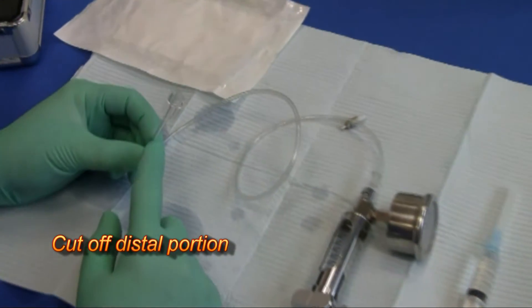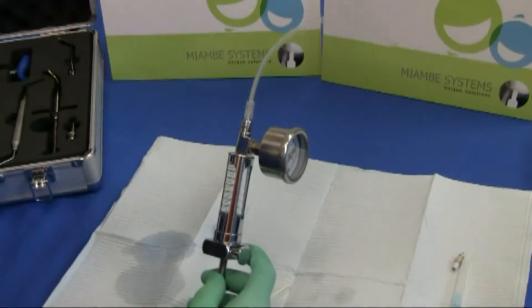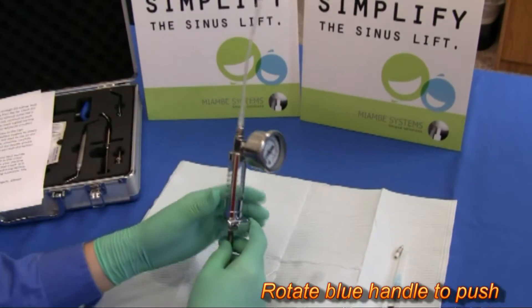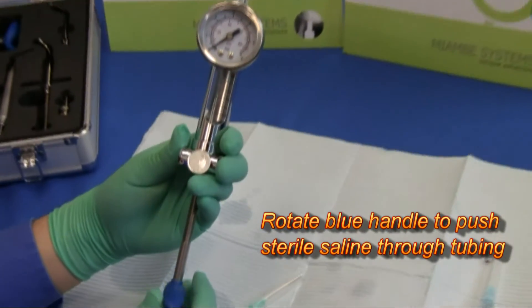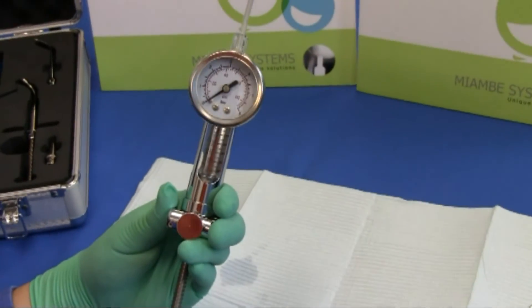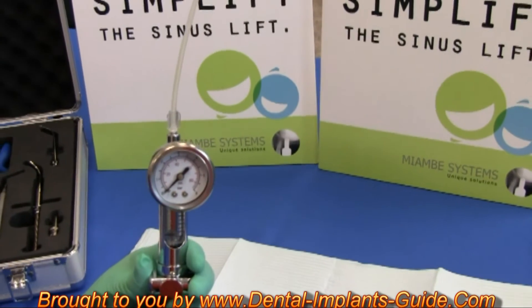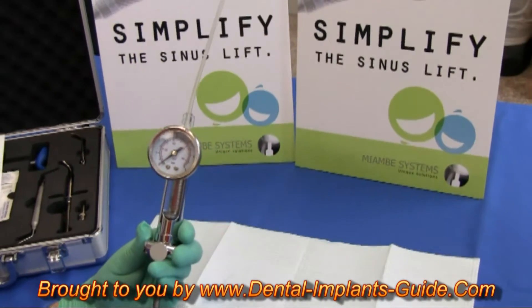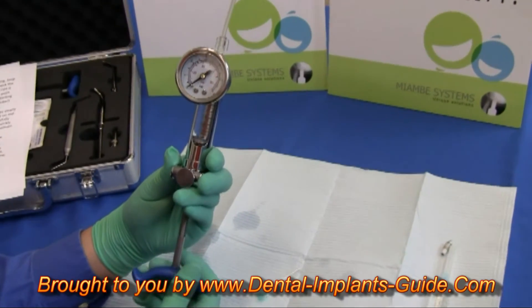After the tubing is attached, cut off the distal portion using sterile scissors. Elevate the tubing and turn the blue handle to eject liquid through the tube. Remove any air bubbles. You want to stop the plunger along one of the lines for easier measuring later.